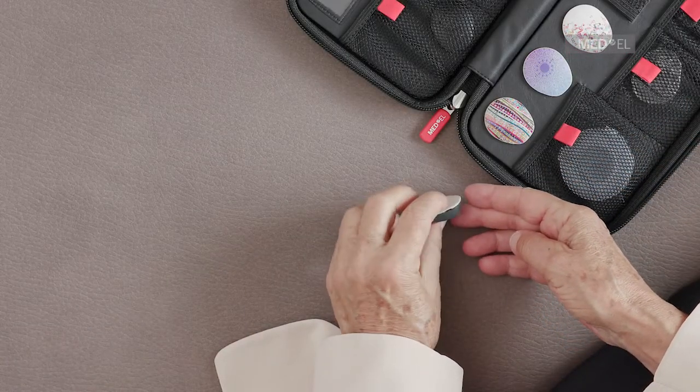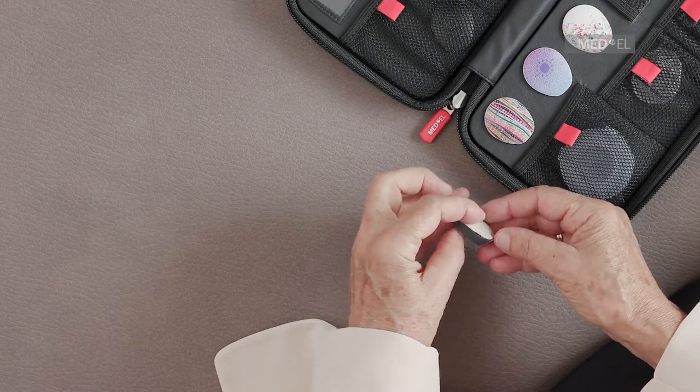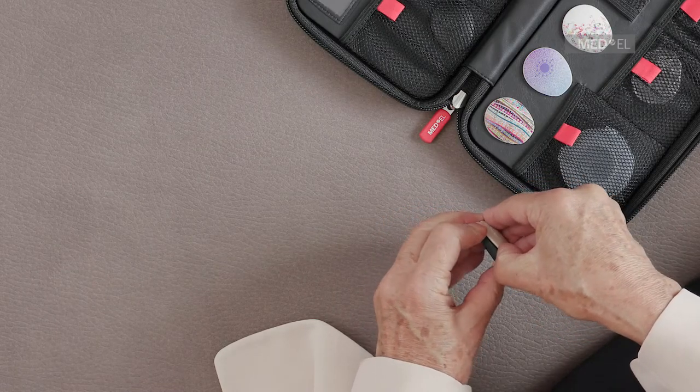Before changing the cover, first make sure the battery compartment is closed. Position your finger in the groove just under the edge of the cover. Gently lift up to remove the cover.